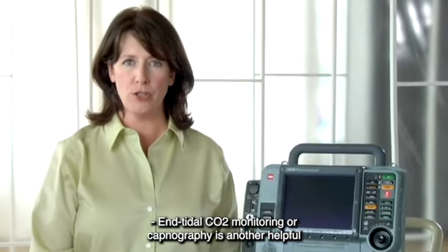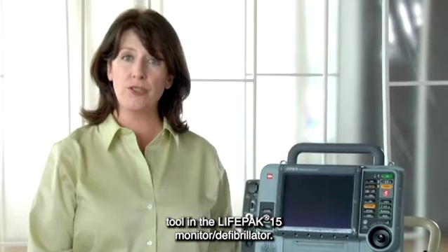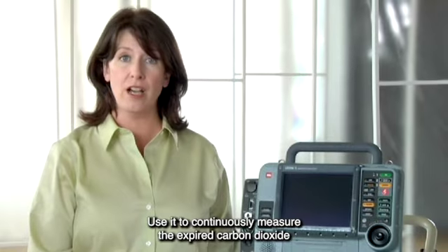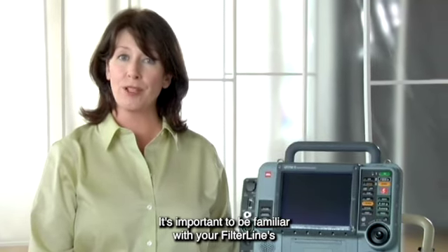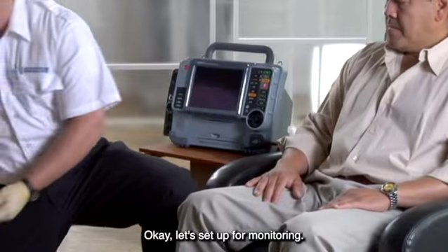End-tidal CO2 monitoring, or capnography, is another helpful tool in the LIFEPAK 15 monitor defibrillator. Use it to continuously measure the expired carbon dioxide in adult and pediatric patients. It's important to be familiar with your filter line's instructions for use. Okay, let's set up for monitoring.